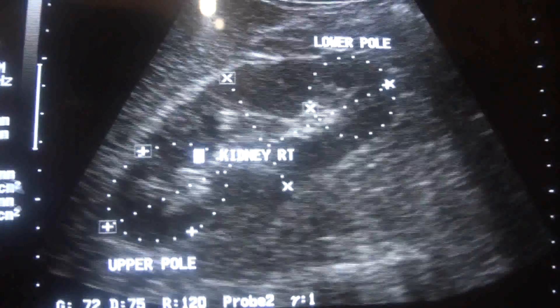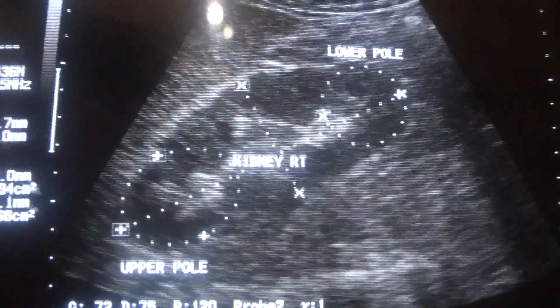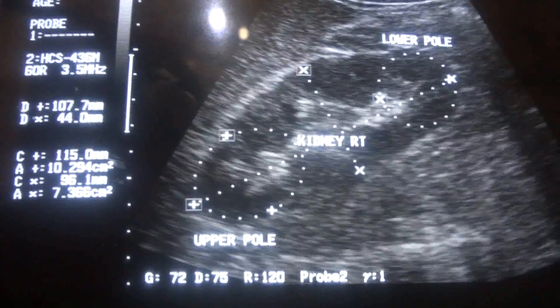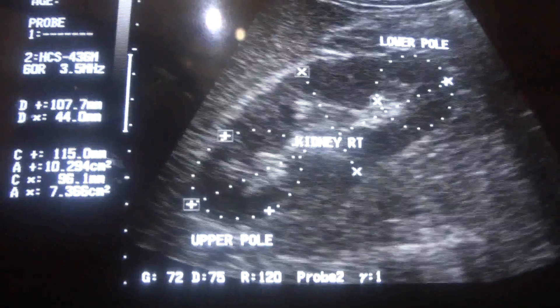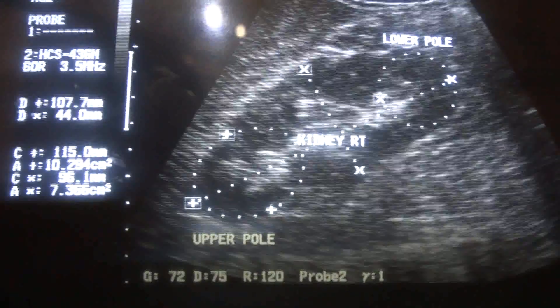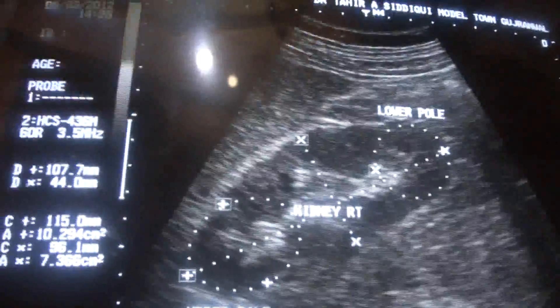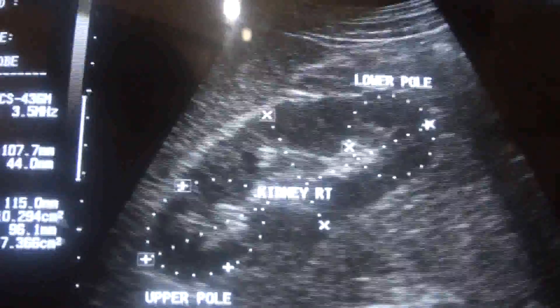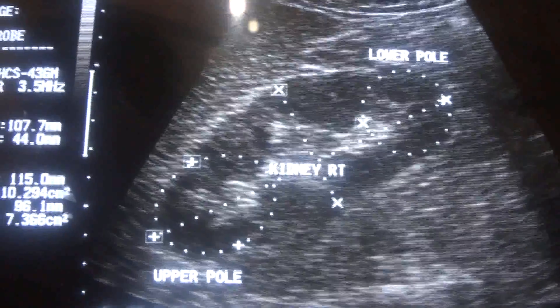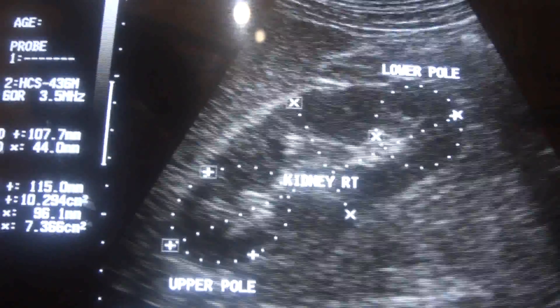There is no hydronephrosis and no focal lesion. The kidney measures 10.7 cm in length and 4.4 cm in anterior-posterior diameter. Normal dimensions are up to 11 cm in length and up to 5 cm in AP diameter — above 5 cm is not normal. So this is a normal kidney. Now we proceed to the patient.